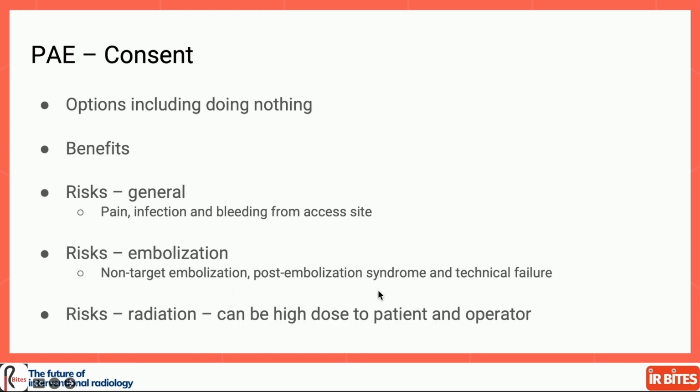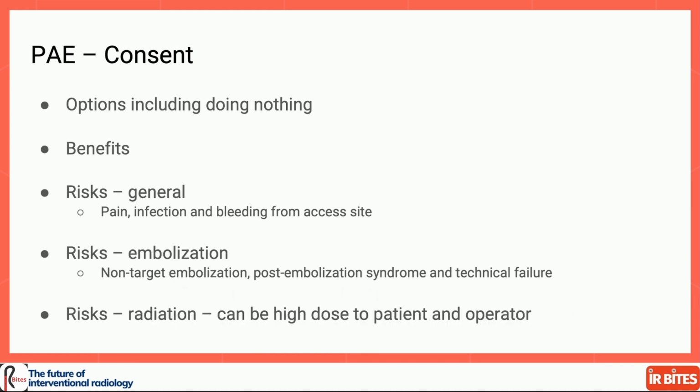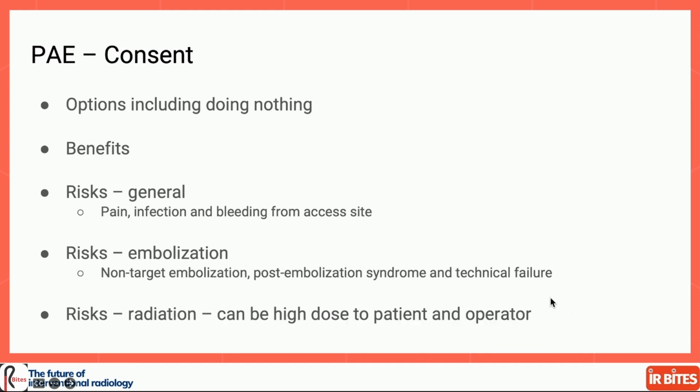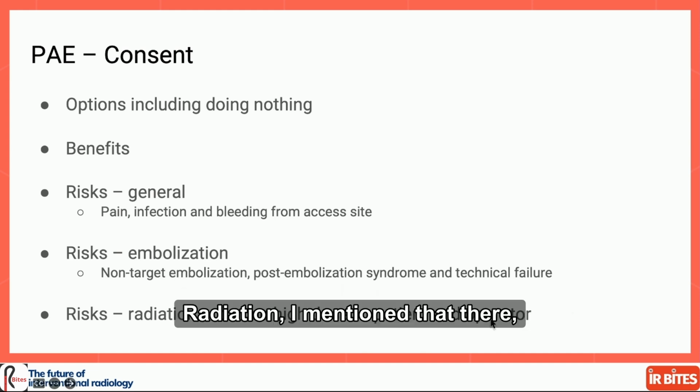Post-embolization syndrome lasts a few days, not very long. The patient might feel mild fever, nausea, vomiting. And this is also important: technical failure. Despite all that planning, you may still not be able to get into the prostate artery. Radiation, I mentioned that there.